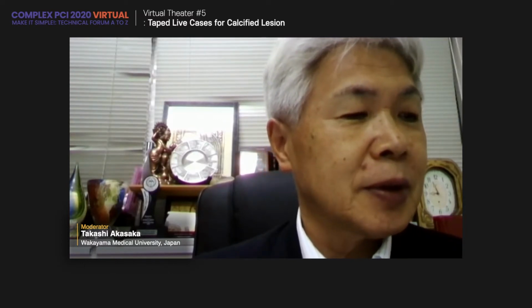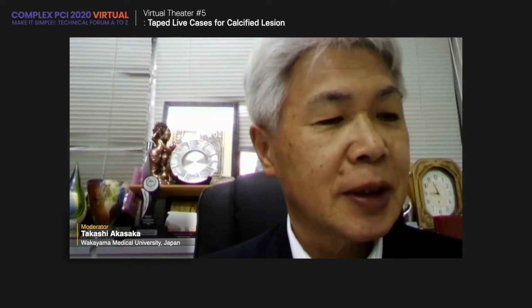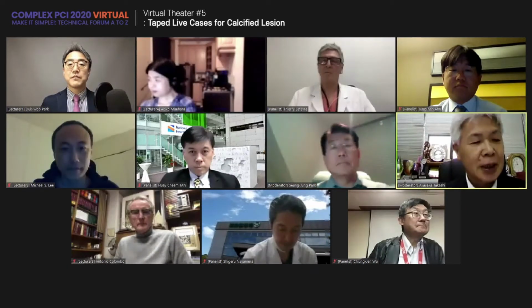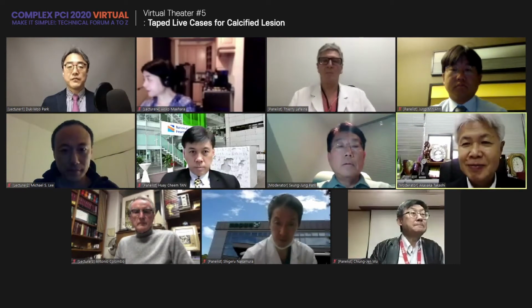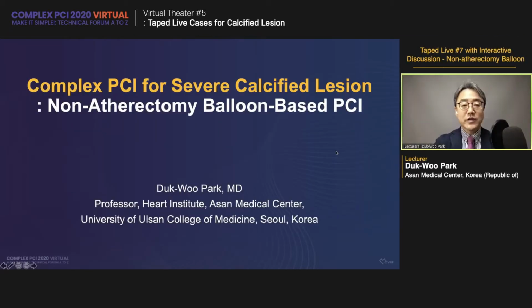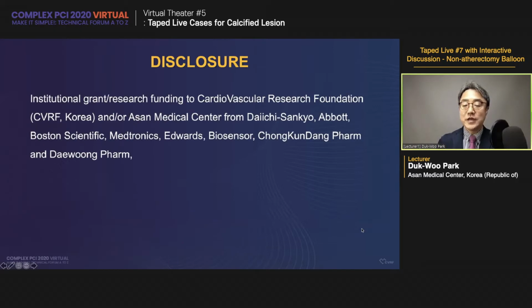It's taped live case number 7 with interactive discussion: non-atherectomy balloon. This will be presented by Dr. Duk-Woo Park. Thank you, Dr. Akasaka, and thank you to the moderator and the panel. I'm very happy to introduce one very complex case that I recently experienced. During the lecture I have an interim discussion time, and after finishing the lecture I have remaining discussion time. This is a typical case of severe calcified lesion, non-atherectomy balloon-based PCI.